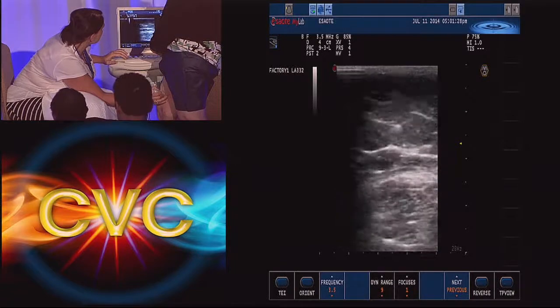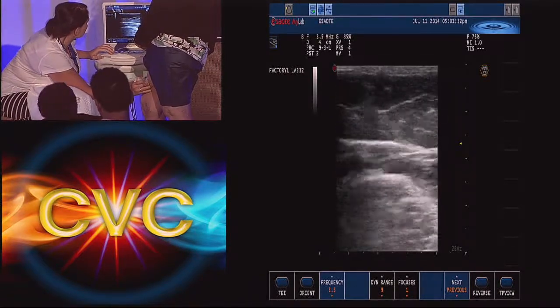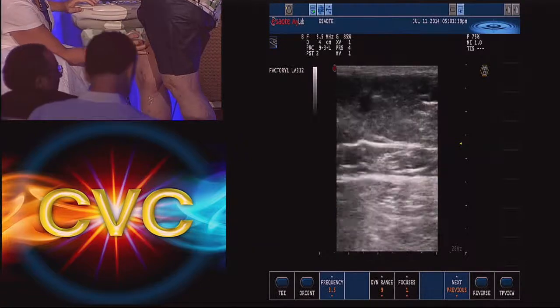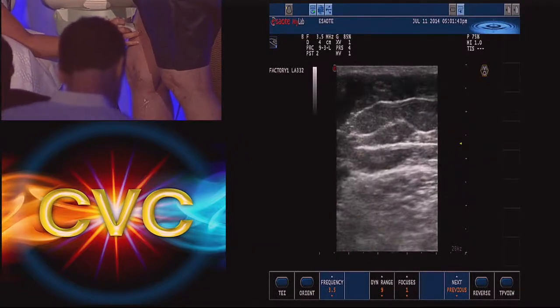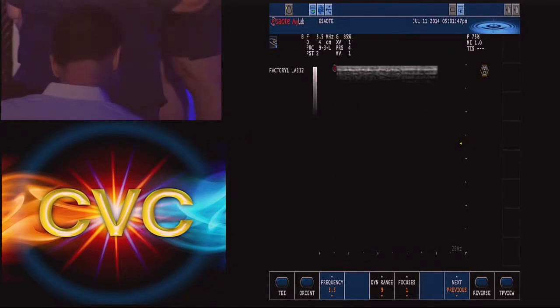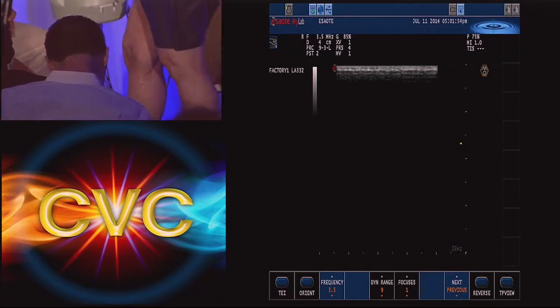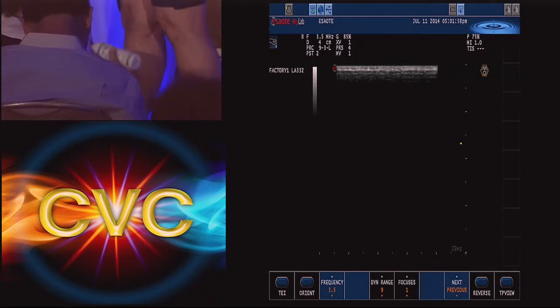I have a hard time believing that. Something else. I would do a venogram. I wouldn't sclerose the collaterals before you. You already did a venogram? Oh, well, then CT isn't like the... You know what happens is when a vein is completely chronically occluded for a long time, it becomes isodense with the tissue, and it can be misinterpreted. So I would go with the actual venogram.